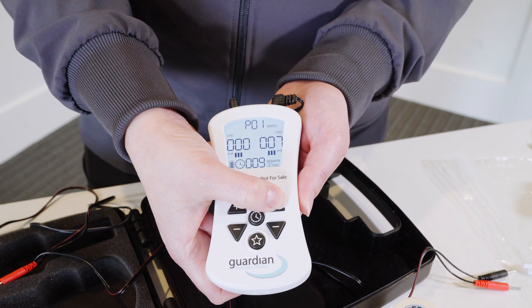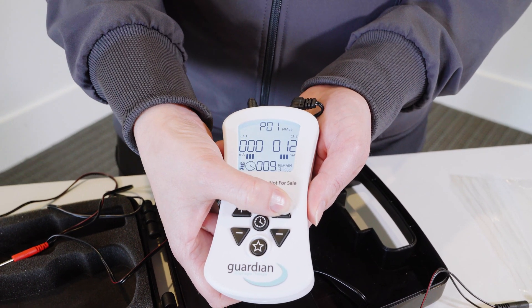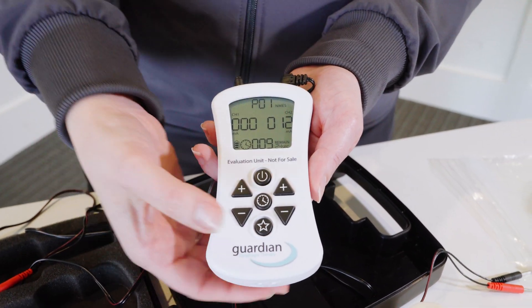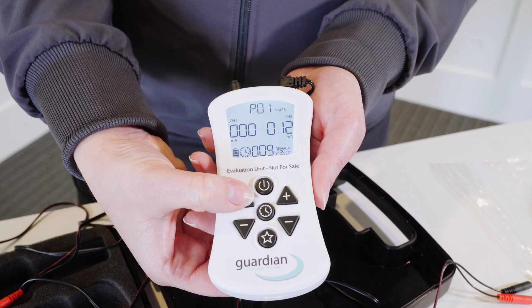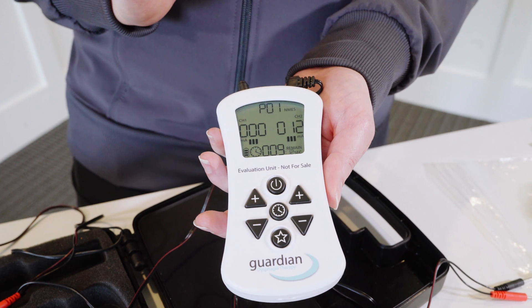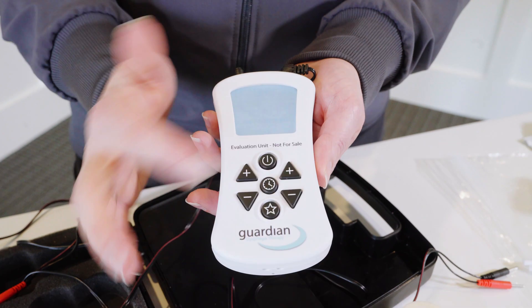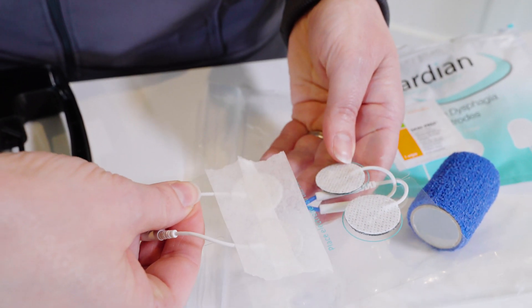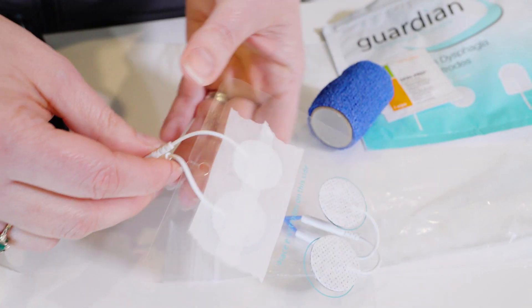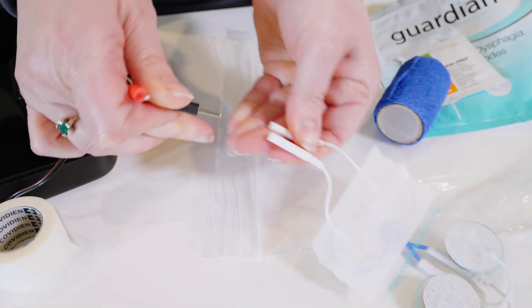This ensures that the patient won't have an abrupt change in amplitude or sensation during the treatment. If you're using both channels, follow the same steps with the remaining channel during the stimulation. Once the device has gone through its cycle and the time is up, it will say 'done' on the screen and you can power down. When done, place the electrodes back on the plastic — always on the side with the writing, as it's laminated to make them easier to peel back off — and then unplug.